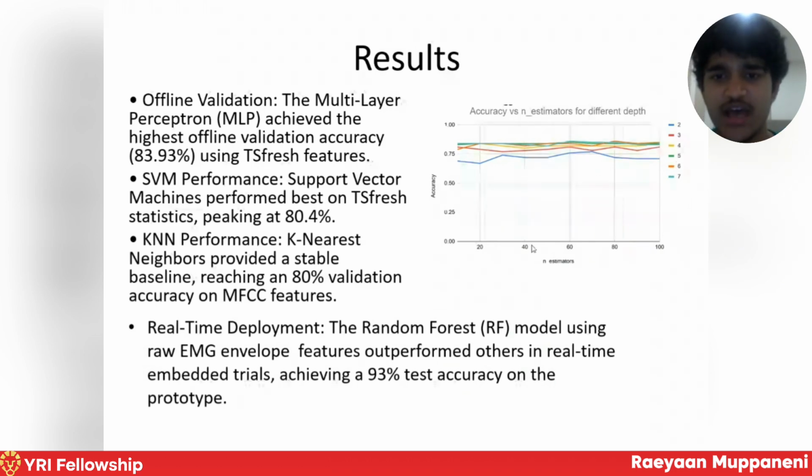And then for estimators, I took around 20 because that's where the accuracy seemed to peak and be more consistent. Additionally, I wanted to make sure the hyperparameter value was lower so that it was more efficient on time.